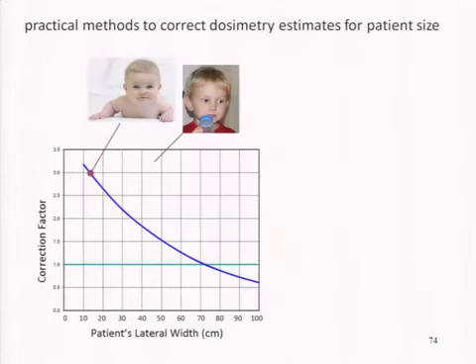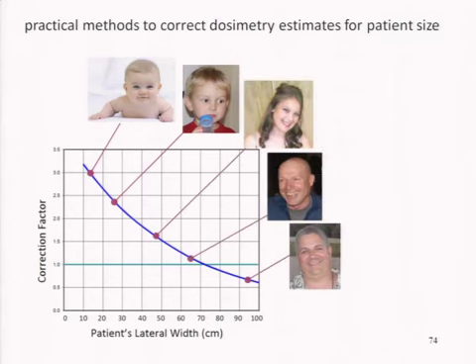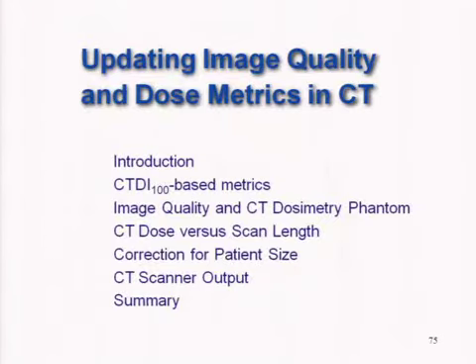And we've also talked about correction factors, and Diana will talk about this in more detail in a few minutes, about correcting for patient size. It's a more dramatic correction here. And so with all these, we think that we can come up with a better dose estimate, and we're trying to use the word dose estimate as opposed to dose calculation to convey to all users of this information that it still remains an estimate, and it's not meant to be a plus or minus 5% dose calculation as our therapy colleagues are sort of required to do. And with that, thank you for your attention.